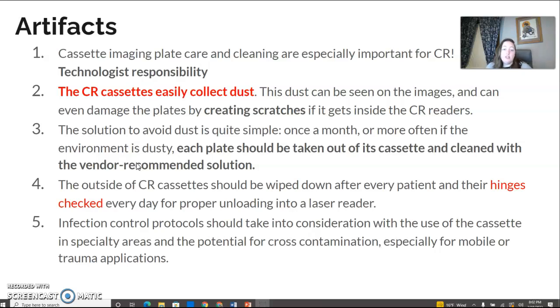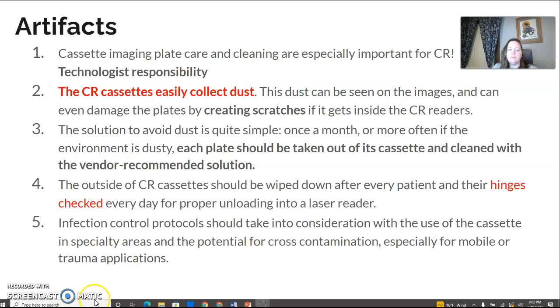Check your hinges. If there's a hinge issue and you're putting the plate into the CR reader and getting an alert or it's not taking the plate out, it's most likely an issue with the hinges — those little locks on the outside protective area. For infection control, just like with your DR cassettes, put a bag over it and use cleaning wipes. Do not pour cleaning solution down into your cassette.